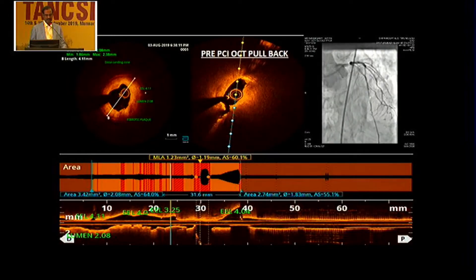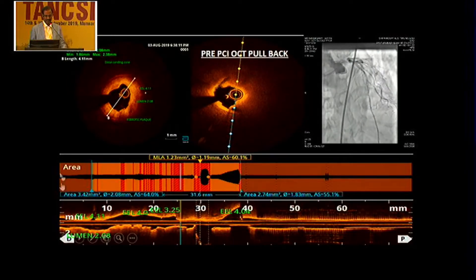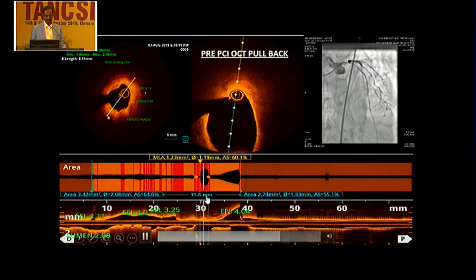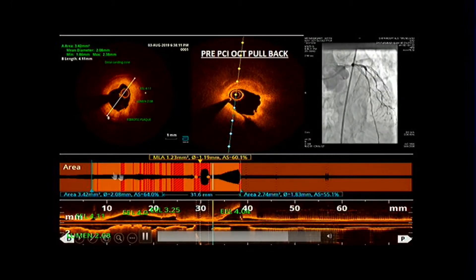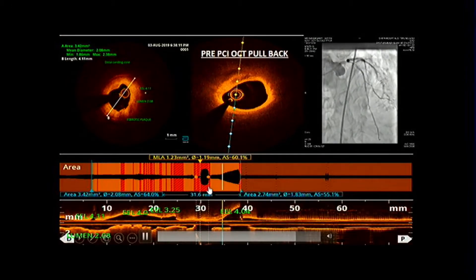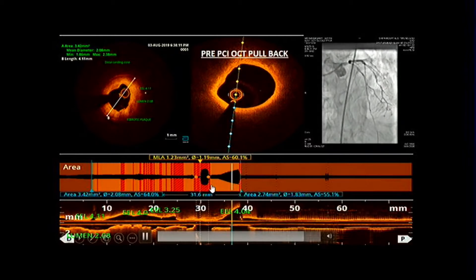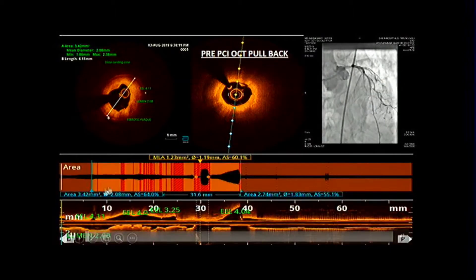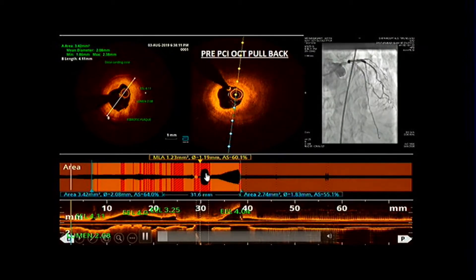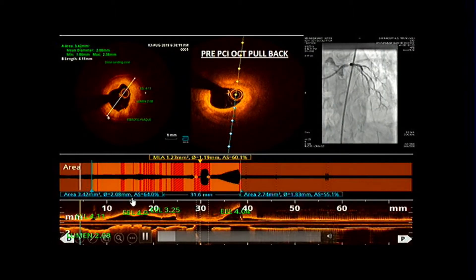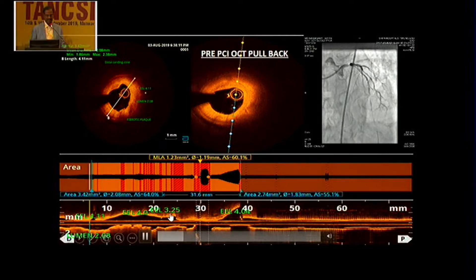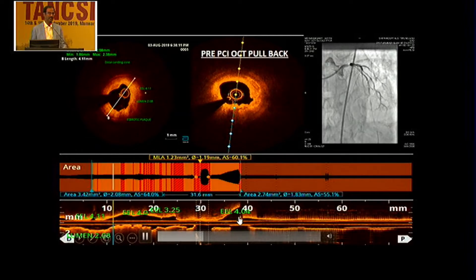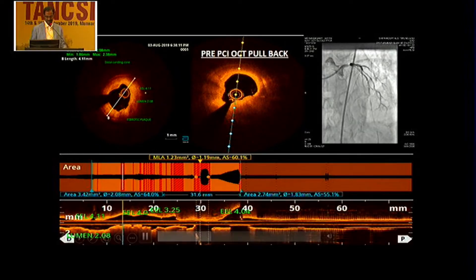If you carefully see, the lesion length from the ostio left main to the landing zone was measured as 31.6 mm, as pointed out by Dr. Shokuma. The diameter of the vessels was also detected, guiding how much post-dilatation balloon to use — 3.25 EEL in proximal LAD and 4 EEL in proximal left main.